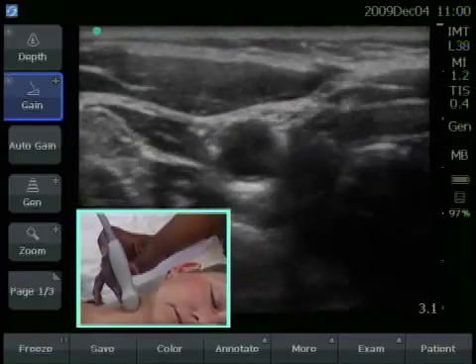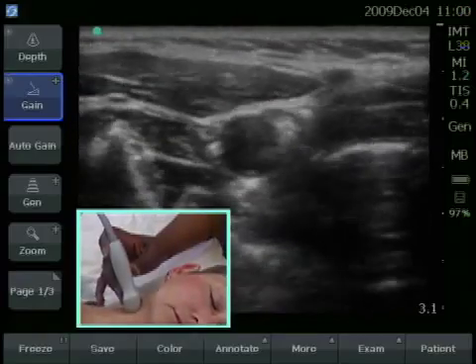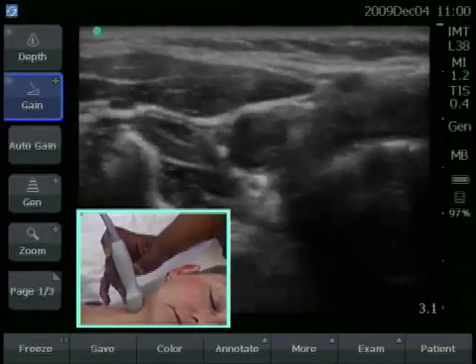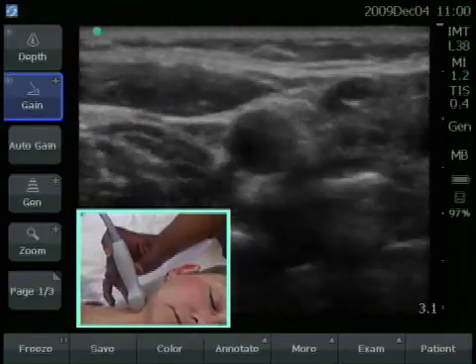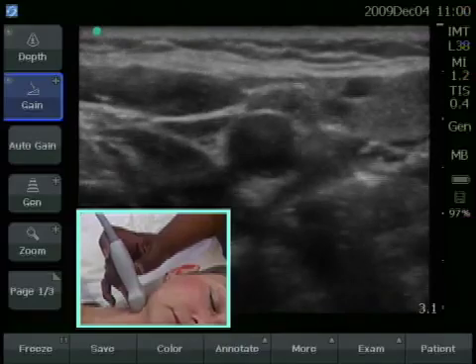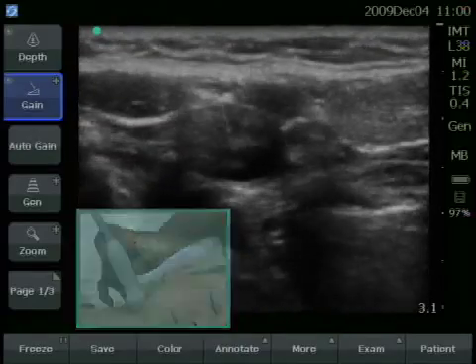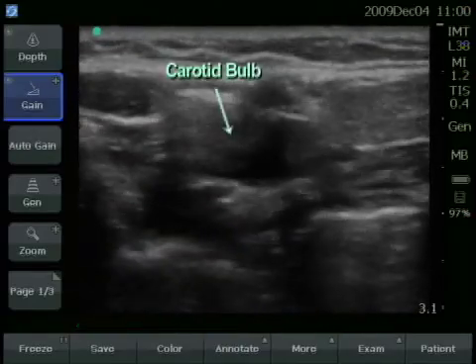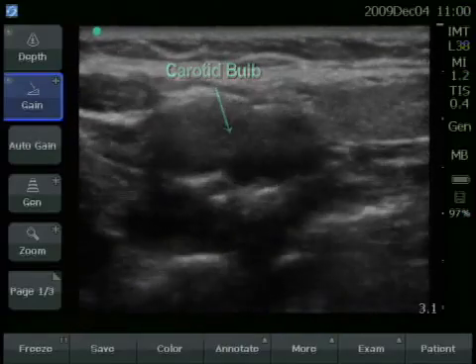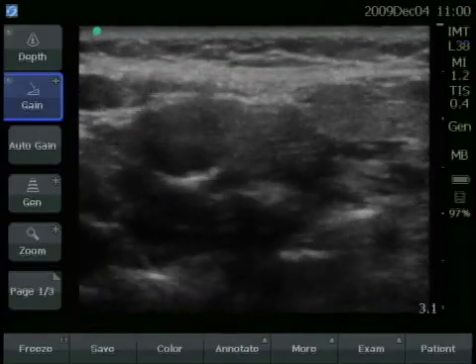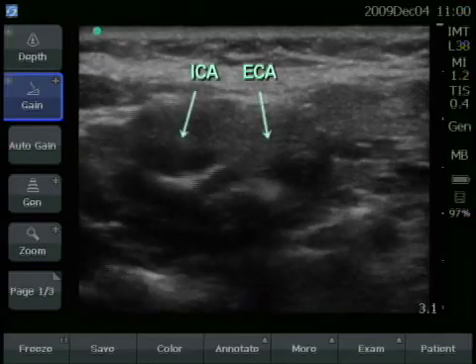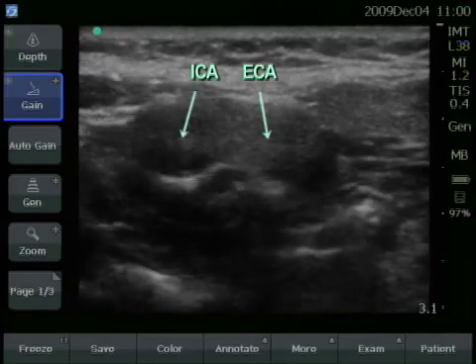Continue to scan up the neck in a transverse manner, and when you start to see the vessel get wide, you know you're in the bulb. Continue scanning through to see the internal and the external carotid artery.